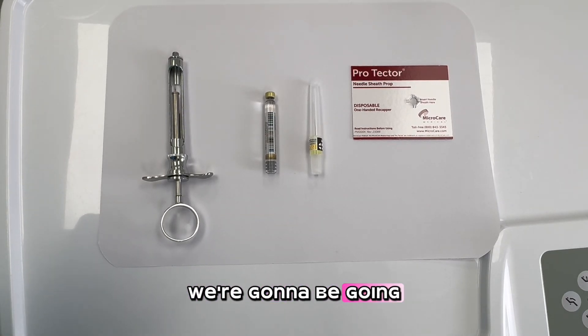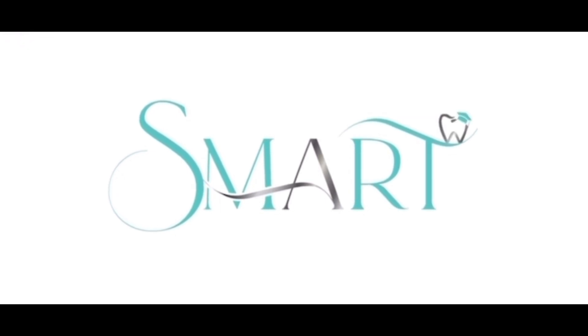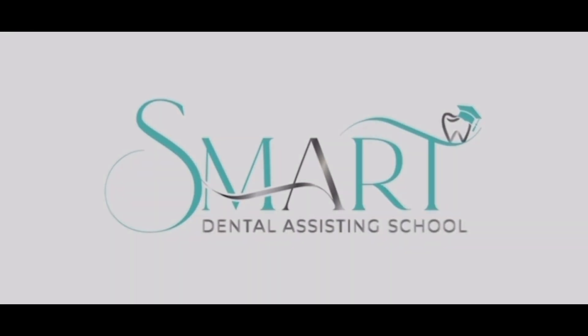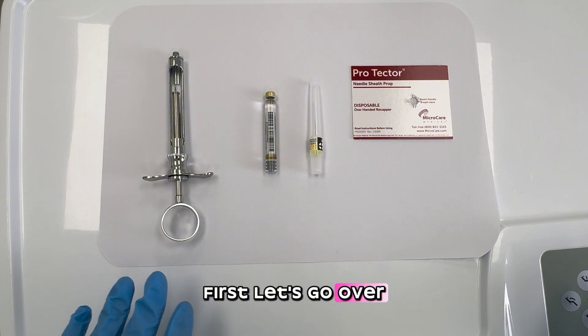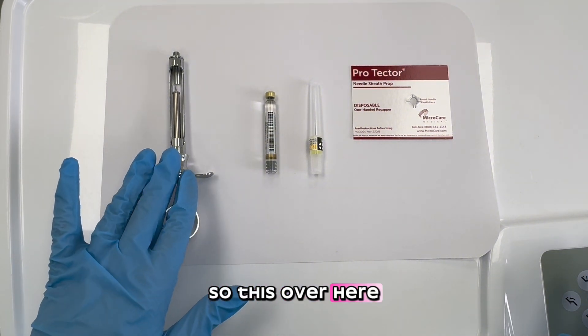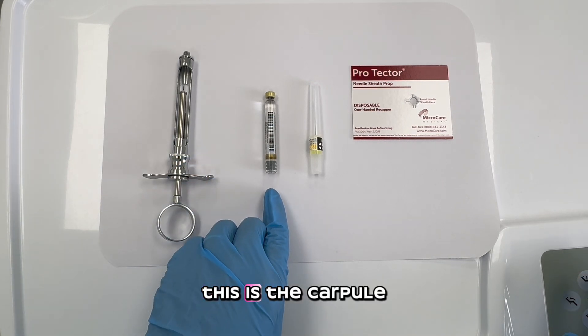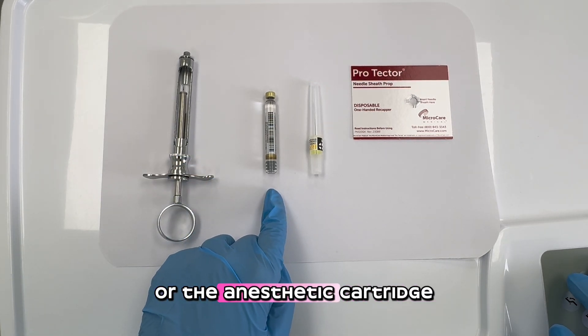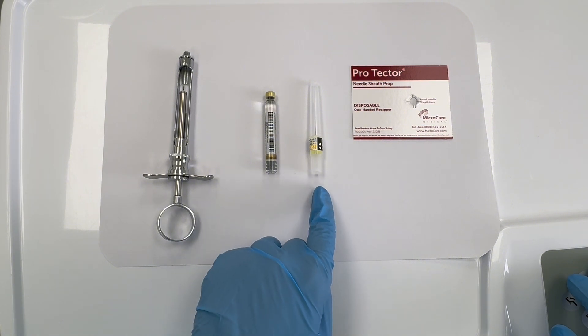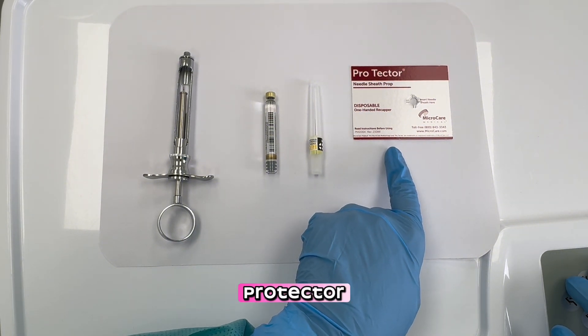In this video, we're going to be going over how to assemble the anesthetic syringe. First, let's go over the equipment and supplies. This over here is the aspirating syringe. This is the carpial or the anesthetic cartridge. The needle and the needle sheath protector.